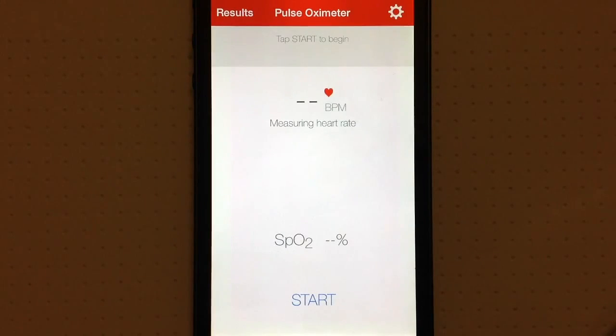Technicalities aside, Pulse Oximeter uses your iPhone's camera and flash to get a reading of your heart rate and oxygen levels. When you first open up the app, you go through a few basic tutorial screens that show you how to start using the app, and once you get through that you're taken to the main screen where you will do your reading.